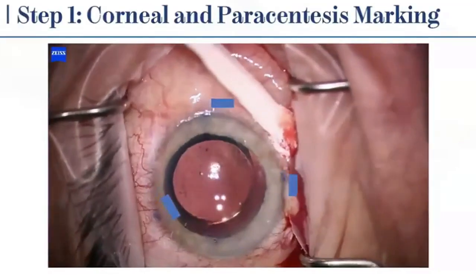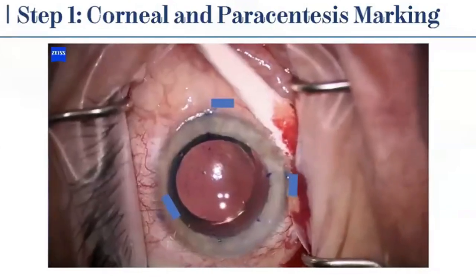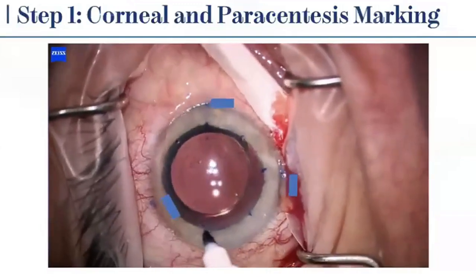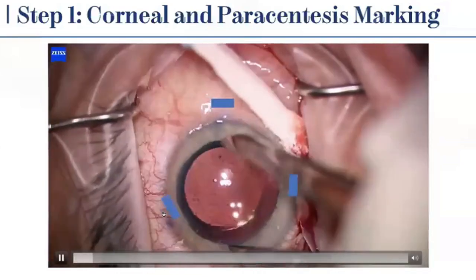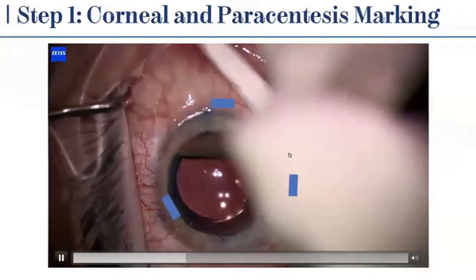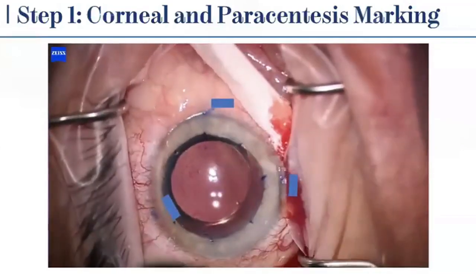Starting with step 1, if it's after cataract surgery, after the IOL implantation, I will mark my cornea with the caliper with the desired size, without removing the viscoelastic, and I also mark my paracentesis at this stage. You can do one inferiorly, that will be for the AC maintainer, one nasally, and one superiorly, and you already have your main incision here.